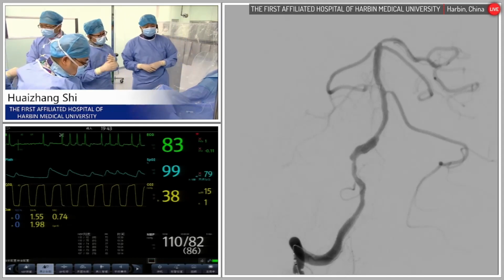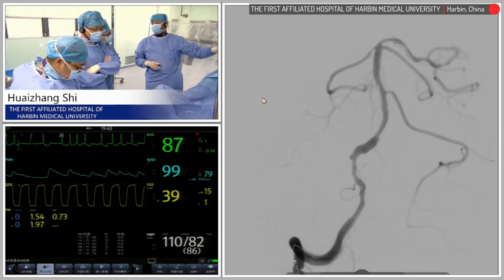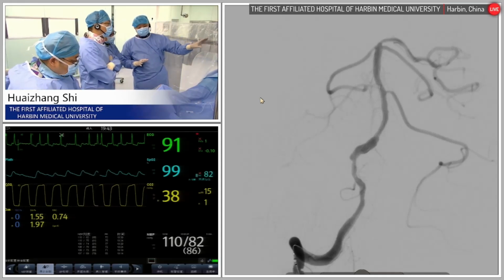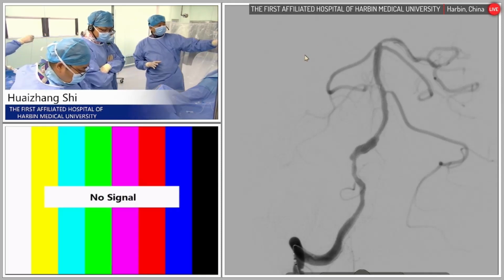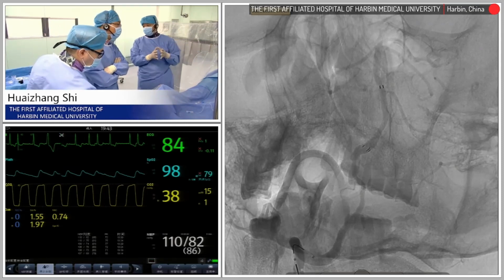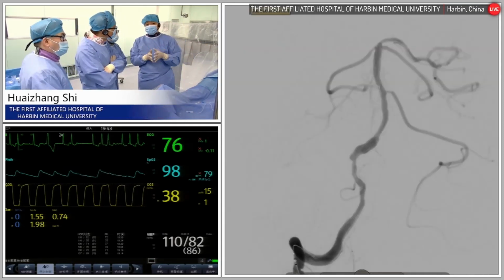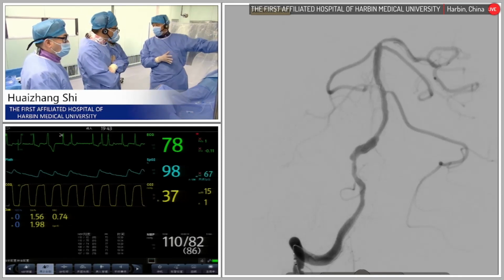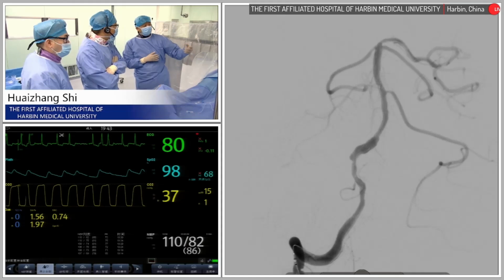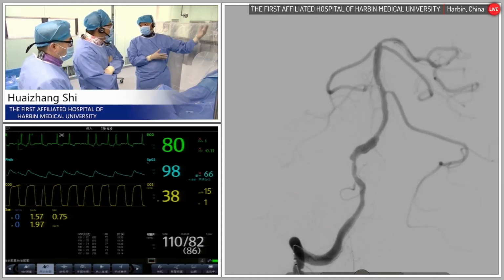That is why you want to change the whole system. What's the reason behind this? Because it's too stiff, I think. If the Fastunnel system is still in the vertebral artery, and we take the angio, we show the spasm, and we can't tell if the lesion is good. So I retrieve all the system and take angio, and we can see clearly the whole lesion.